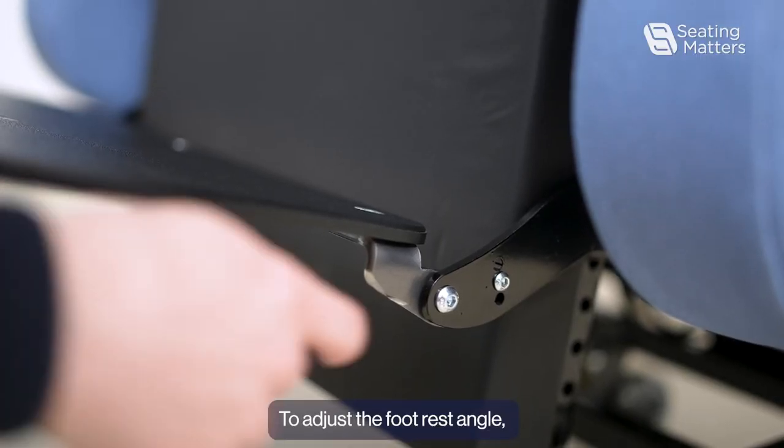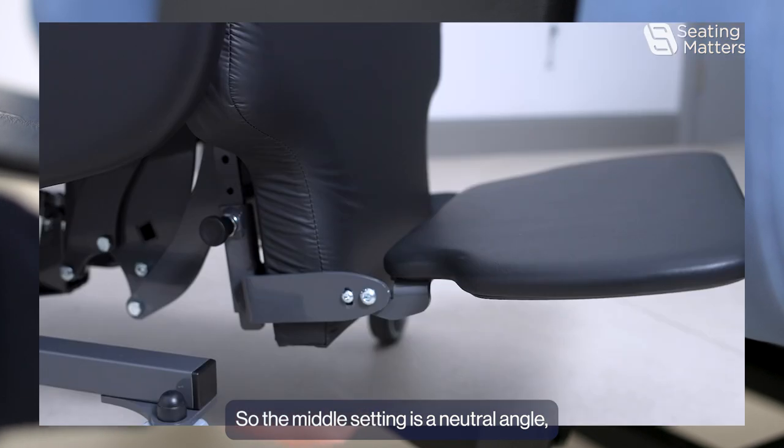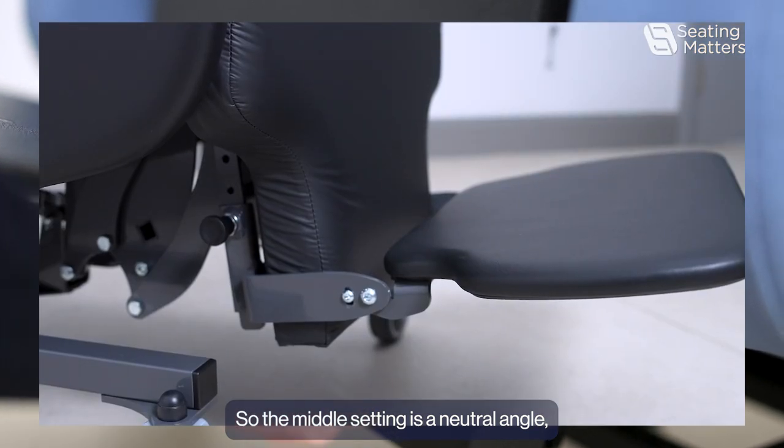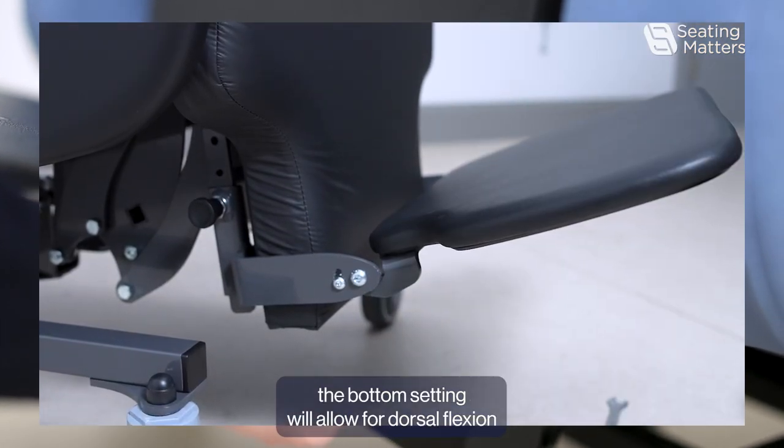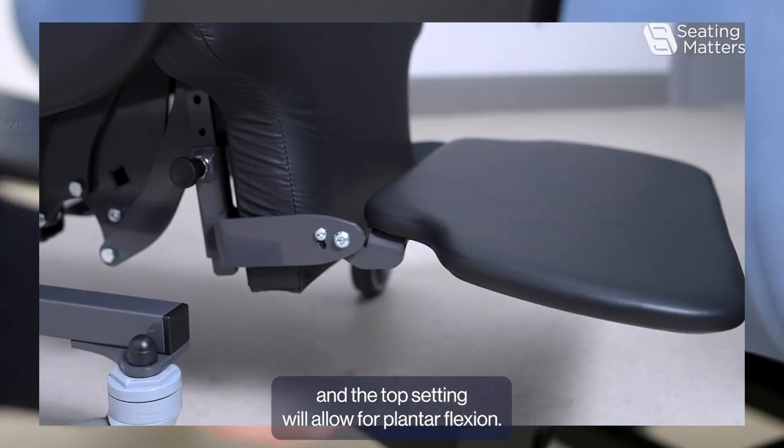To adjust the footrest angle, we need to choose which setting we require. The middle setting is a neutral angle, the bottom setting will allow for dorsal flexion, and the top setting will allow for plantar flexion.